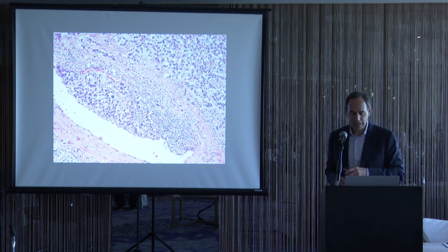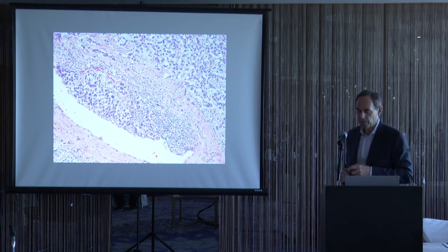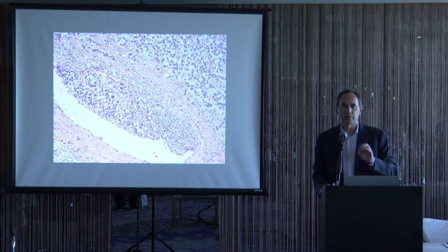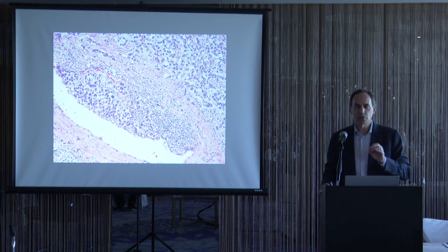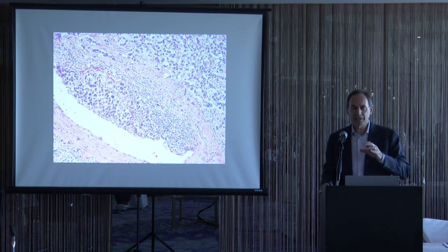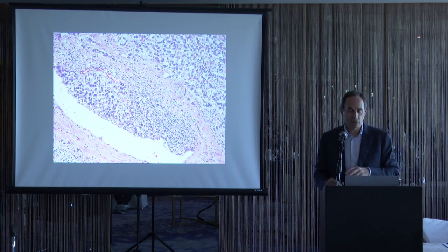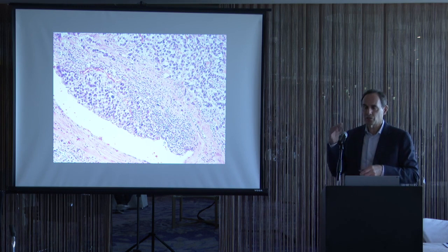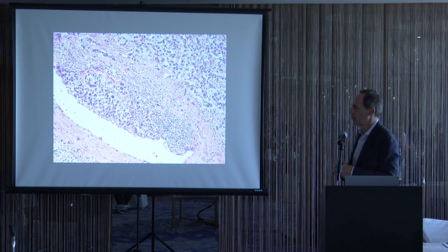So these are some examples of true vascular invasion. The trickiest situation to identify vascular invasion is with seminoma. The seminoma are loosely cohesive cells. So when they're in a vessel, even with vascular invasion, the cells will be loosely cohesive, and therefore it's harder to tell versus artifactually displaced loosely cohesive cells. So for me, the threshold to calling vascular invasion in seminoma is elevated. I have to be sure it's a true tumor thrombus.